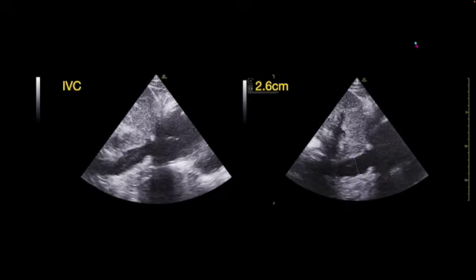All right, so our patient, we know she's in acute heart failure. We looked at the left side of the heart to look at the systolic function. You can take a look at the right side of the heart. And I believe in our cardiac lecture, Dr. Charlotte Durr has shown you how to do that. Sometimes this can be rather difficult. It is sometimes hard to take a look at the right side of the heart with point of care ultrasound, just because in general it's hard to evaluate and see.